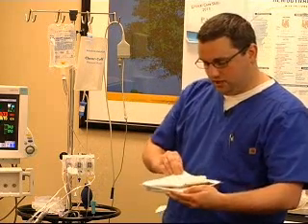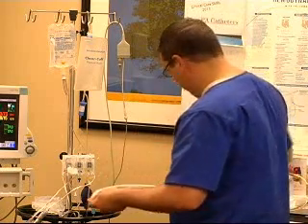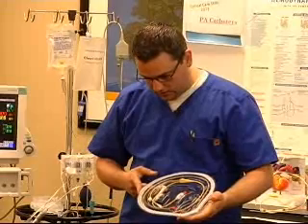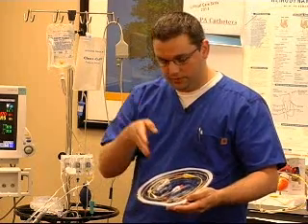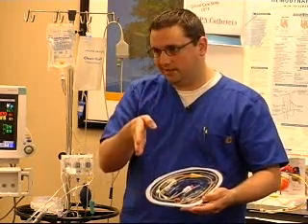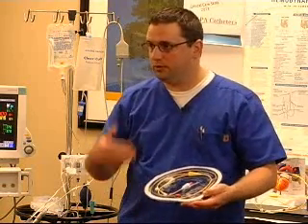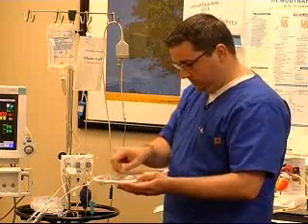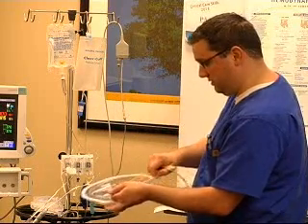So I'll show you what the practitioner is going to do: open this up, and you can see how this comes in the tray. The reason this is in a little preformed curve is so that when the practitioner is putting it in, it has that natural curve, so it'll hook into the atrium, whether you're coming from a femoral approach or from IJ or subclavian. Okay, so what they're going to do is, and since you're sitting here, I'm going to get you to help me.